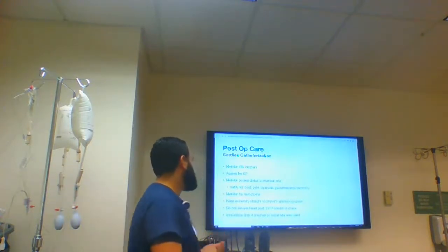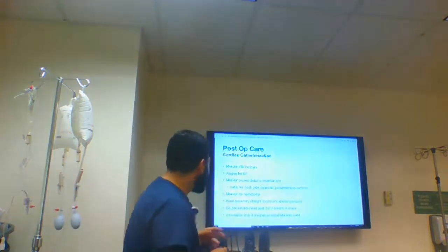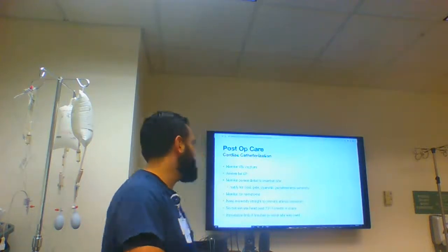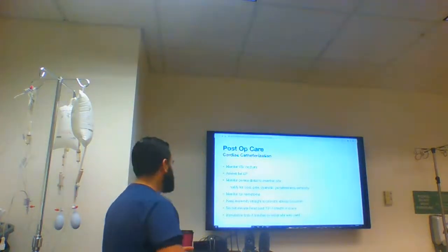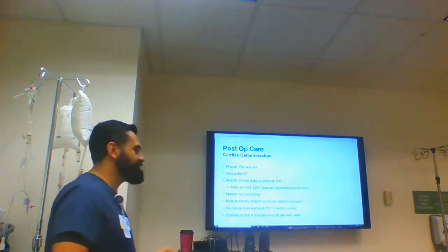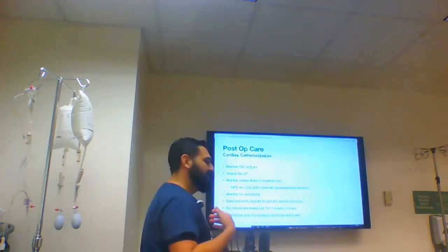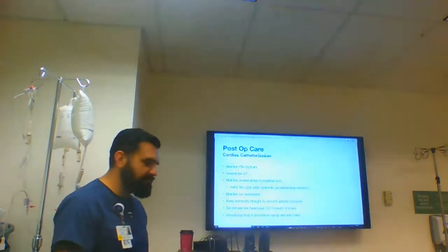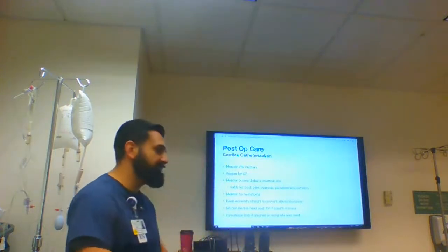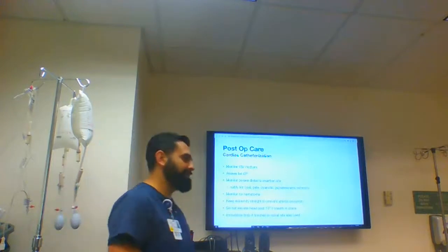So, anyways, post-op cardiac cath, we're going to monitor vital signs, rhythm. I think I spelled that right? That's my least favorite word, rhythm. Assess for chest pain. Monitor pulses distal to the insertion site. You notify your doc if it's cool, pale, cyanotic. Pulse this extremity and compare it with your other one, right? You get a history. Sometimes we have patients with severe PVD and they're already cool. So you call the doctor and he'll be like, yeah, I know.